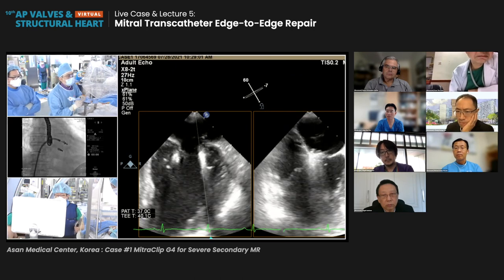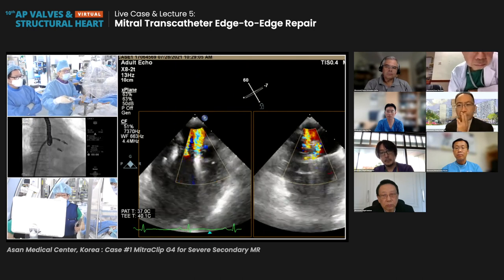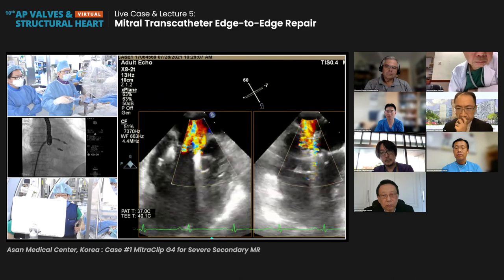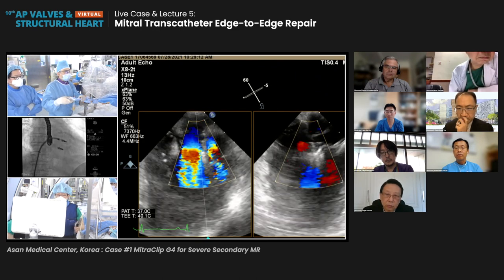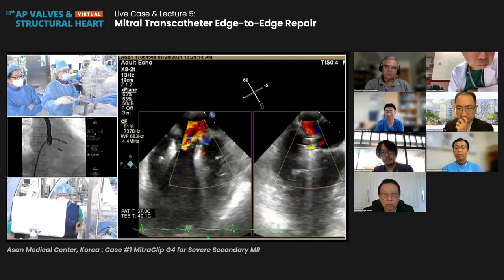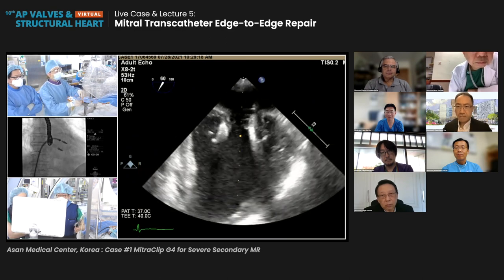Shall we check once? Small close done. I did the 60 degree close. Oh yeah, that's the point. Please close, please. Yeah, close. Yeah, great job. Very nice. Excellent image.